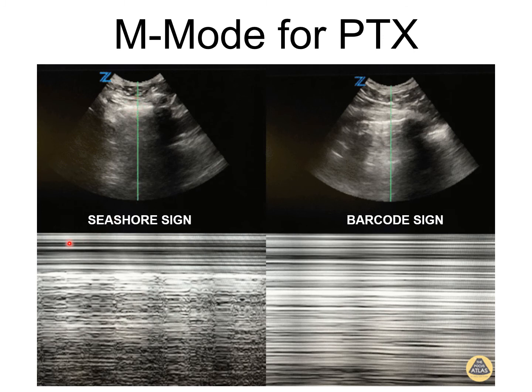So as the patient breathes, those first few things, the skin, the subcutaneous tissue, the muscle, they stay essentially the same over time. But everything below the pleura, which in this case is this bright white line here, moves back and forth as the patient breathes, it scatters the ultrasound signal, and it appears disorganized like this. That means that what's below the pleura is moving, and that means it's lung, it's not pneumothorax.